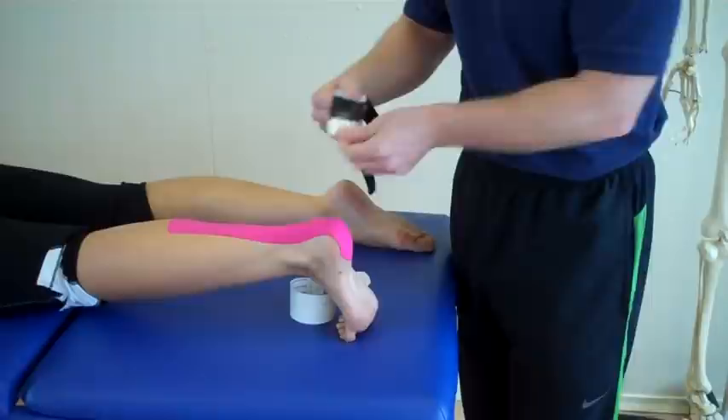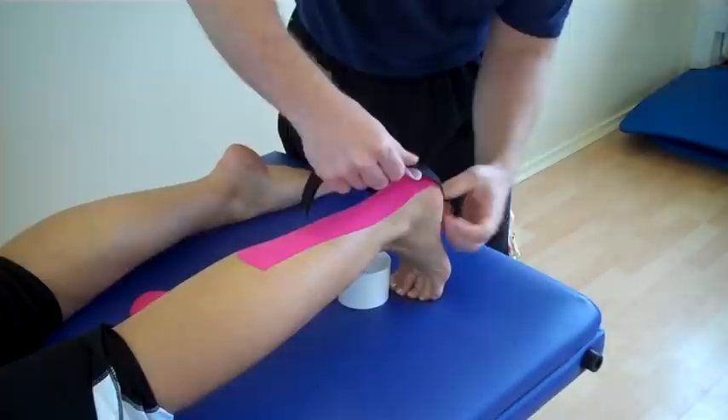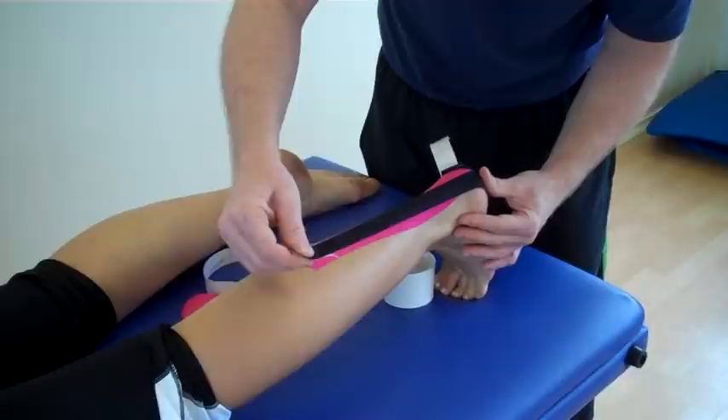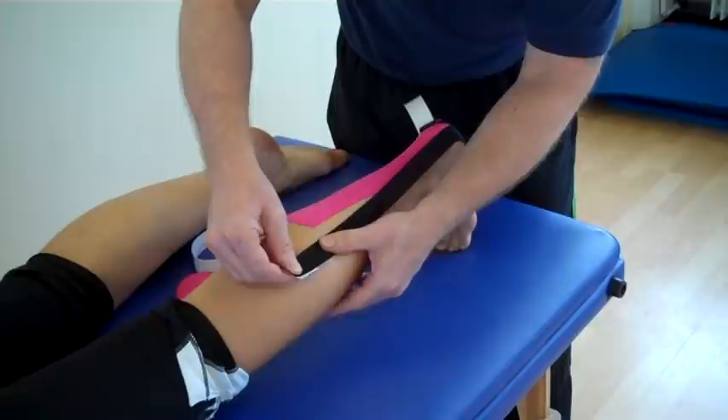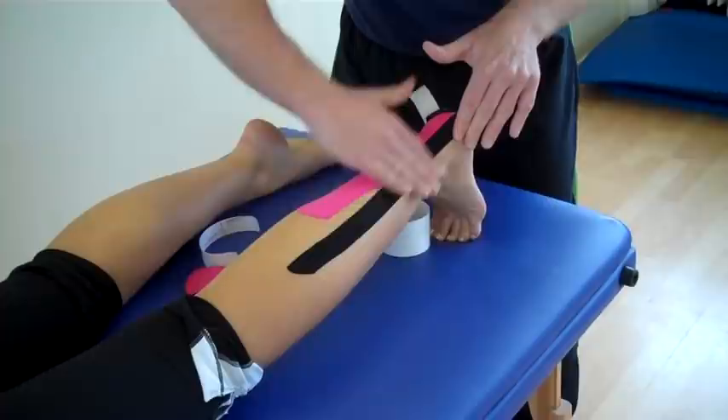For the second bit of tape, we're going to split it again — no stretch — and then apply the tape again over the calcaneus with no stretch. So what we've got this time, we've got two strips. Think about the origin of the gastrocnemius. We've got the lateral head of the gastrocnemius, so we're going to put not maximum stretch — 75% stretch — following the lateral head of the gastroc. The last inch or so, just literally mold that down.